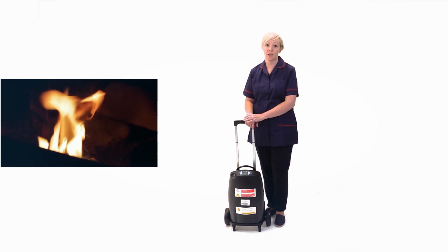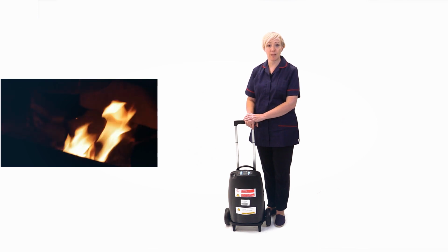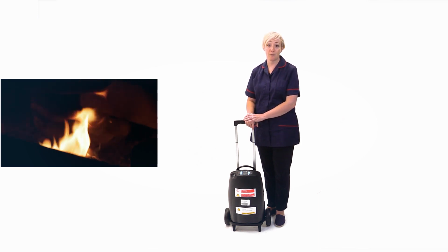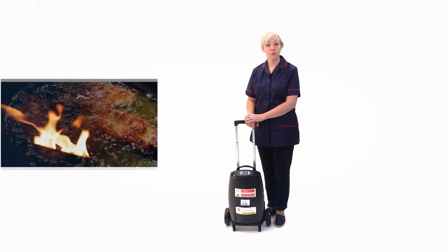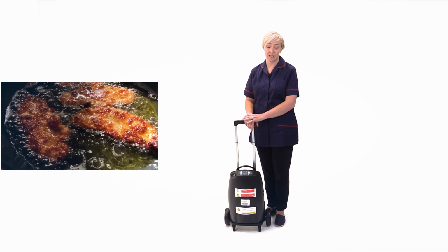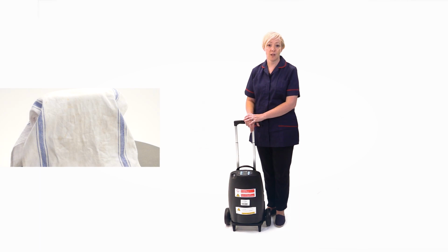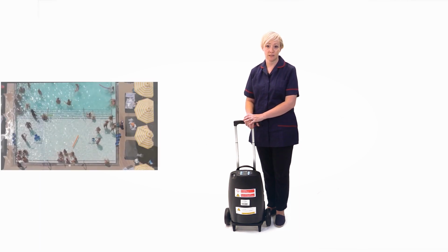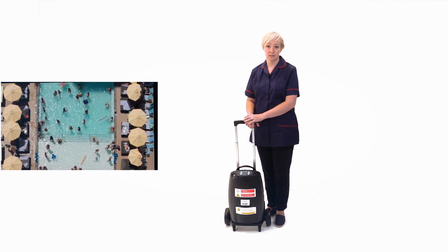flames such as open fires, gas fires and cookers, and at least 5 feet or approximately 1.5 meters away from other heat sources or electrical appliances. Do not use oil or grease, and make sure that your hands are clean and dry before using the device. Do not cover the device with clothing or any other material. Do not operate the device while standing in water.